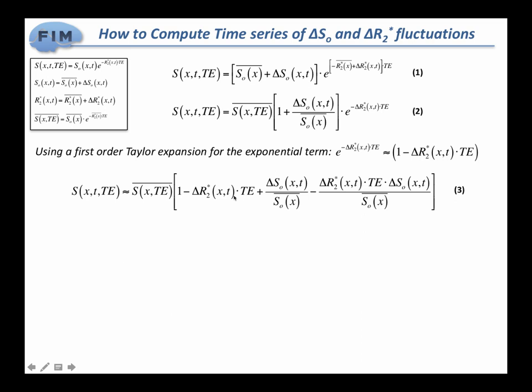So again, just for the idea of simplifying things so we can work through the math, we can take that out, okay? Again, we are doing some assumptions that are to a given extent correct, and because we're doing assumptions and because the data is noisy, this is one of the things that I will ask you not to do with your data, okay? It's just for illustrative purposes.